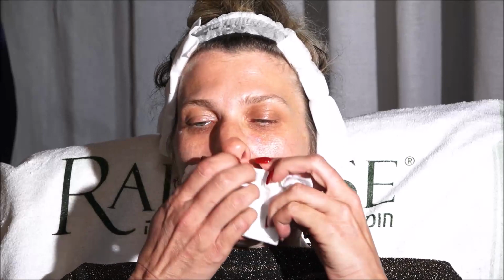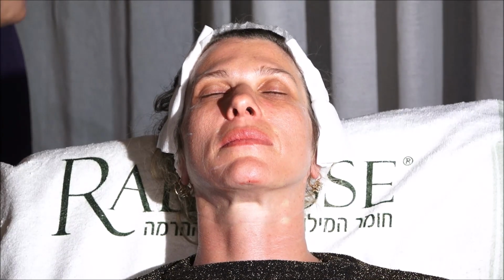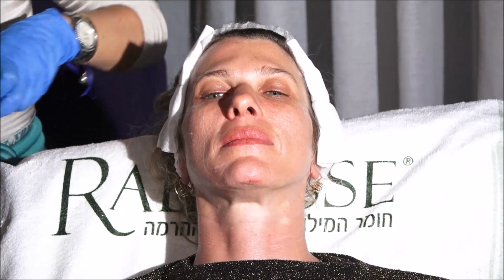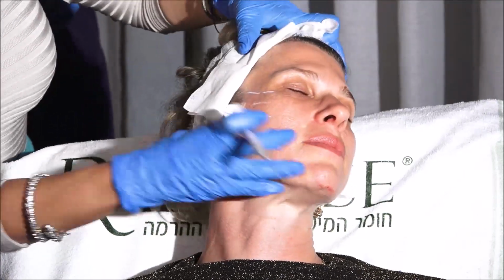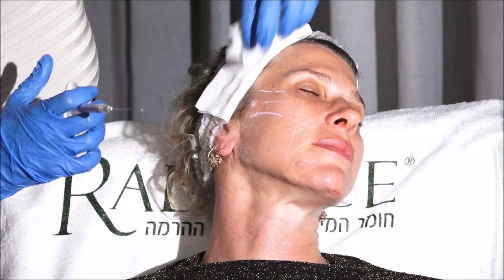Radiesse dilute. The loop. The same cannula. Thank you. So don't forget to protect the hair, because you're going to go like this. I don't want my cannula rubbing the hair.